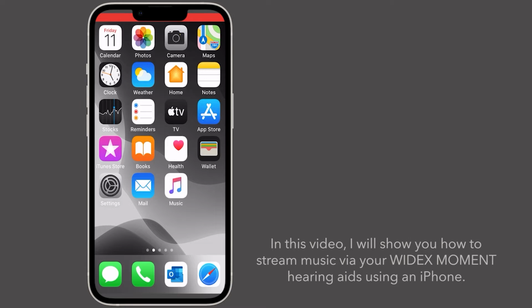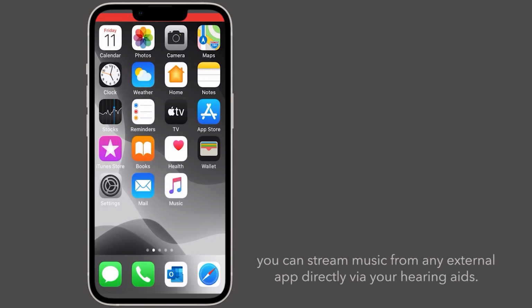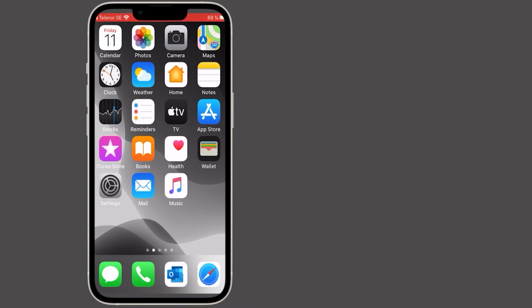In this video, I will show you how to stream music via your WIDEX MOMENT hearing aids using an iPhone. With WIDEX MOMENT direct streaming hearing aids, you can stream music from any external app directly via your hearing aids. If your hearing aids are already connected, your iPhone will automatically stream to the hearing aids.